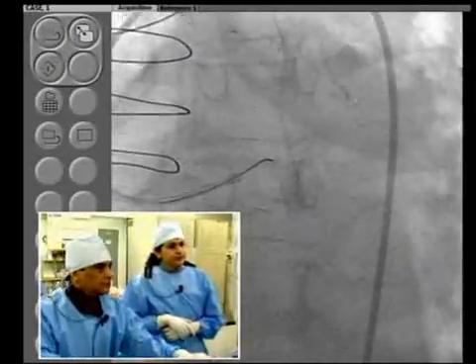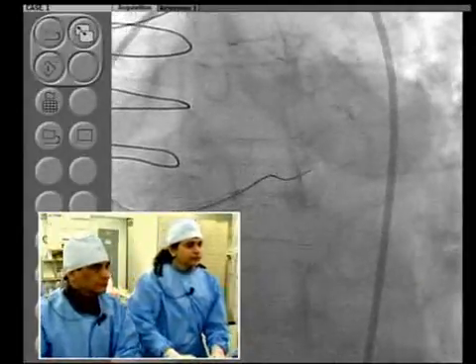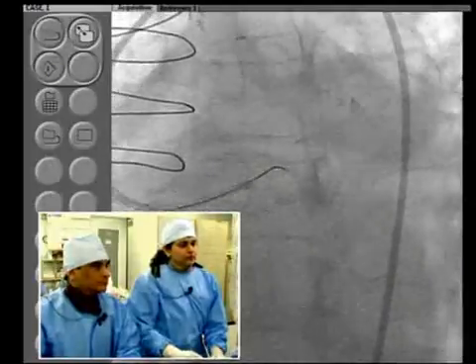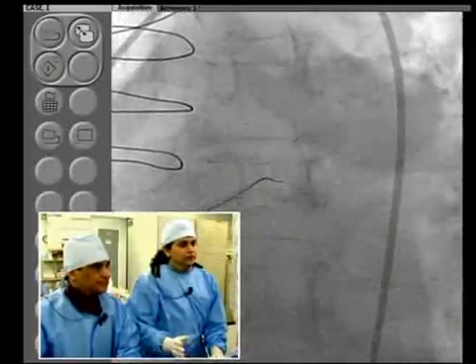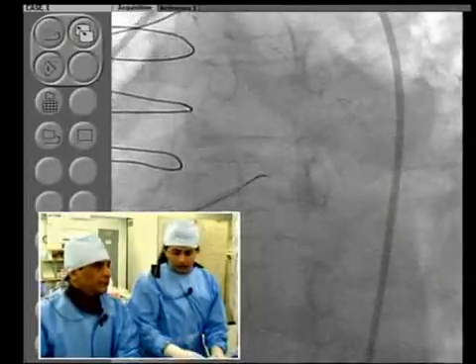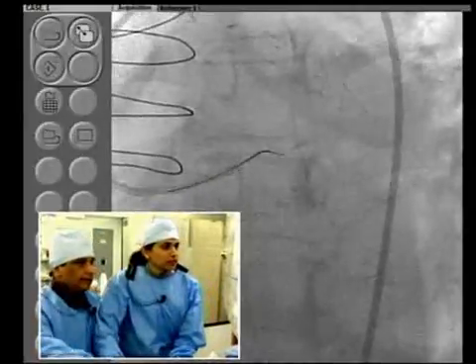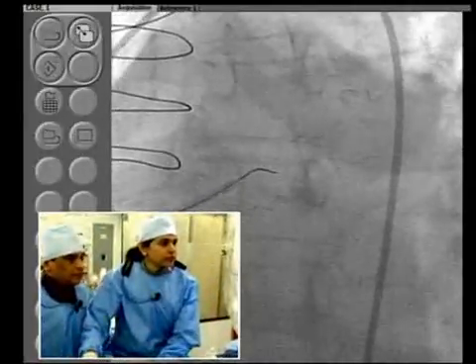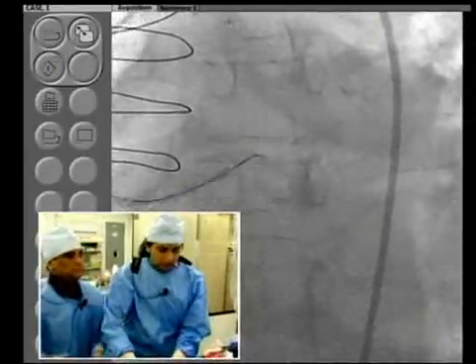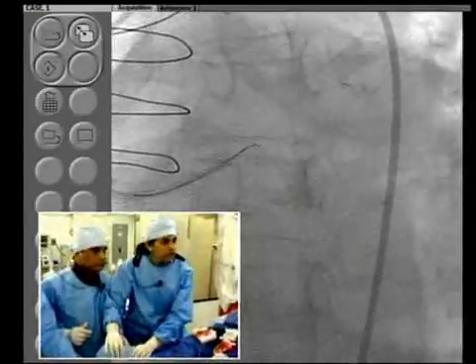Excellent. Samin, I would traditionally use a mini cross or one of those mini little support catheters to make this curve, but I'm very interested in seeing how the Venture performs. Samin, question for you here. Counter? This is highly speculative. Do you think the long-term results of an incredible trial like SYNTAX could be different if you had a substitution of a Xience stent instead of Taxus?